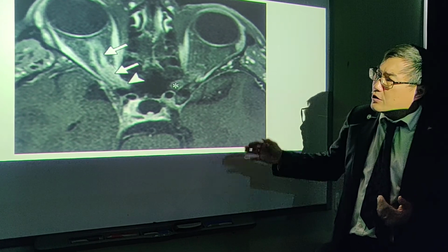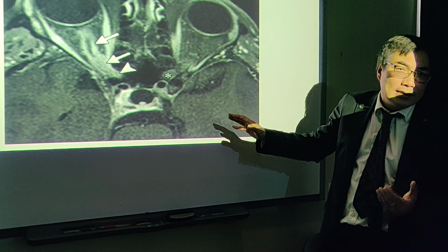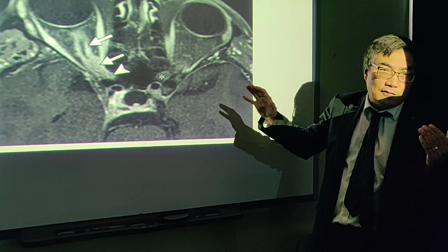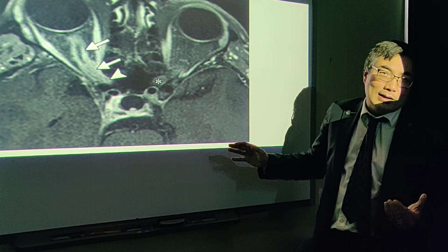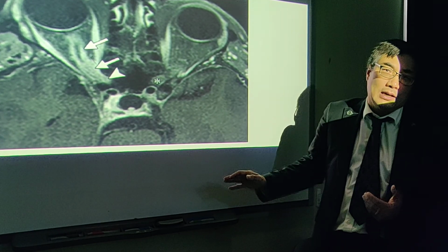So to just know these main imaging parameters for optic neuritis, I think that you'll have a lot better way to divide up the patients who are presenting with optic neuritis. And if it doesn't quack like a duck, look like a duck, and fly like a duck, especially radiographically, you should be thinking about the mimics.